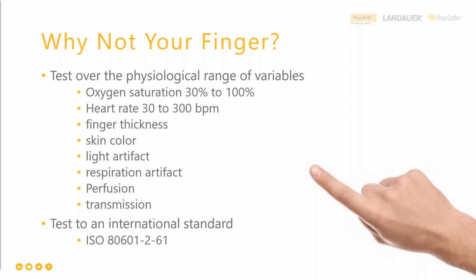So in ProSim 8 with Spot, all the heartbeat signals are synchronized. The ECG and the blood pressure beats are all on the same beat and timed to be physiologically accurate. In fact, the SpO2 signal is derived from the arterial blood pressure beat, delayed to represent the actual delay of the pulse traveling down the arm to the finger. So having that be synchronized helps you have an even better simulation.